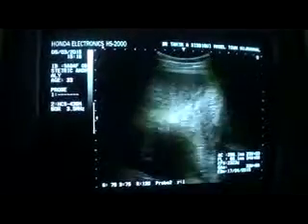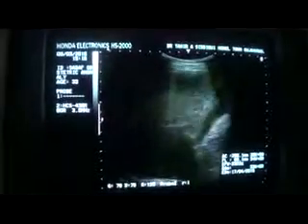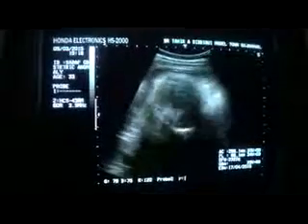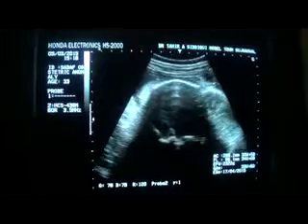in fact, let me show you the picture over here, how I got it. Now you see this is the anterior part of the brain, where I'm showing you now.